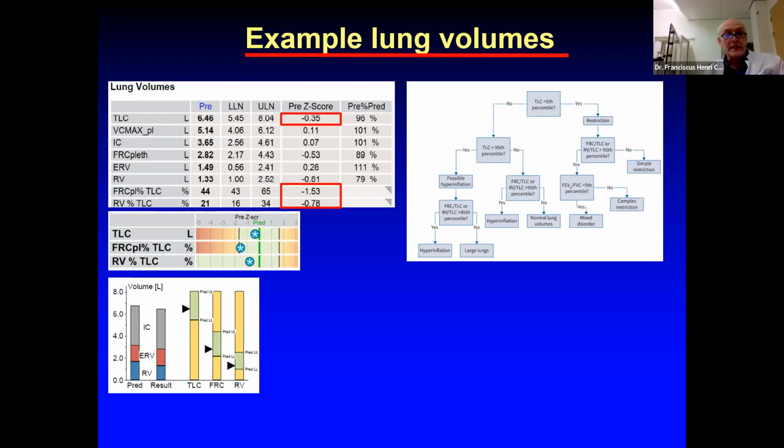And of course, in this example, I didn't give you, for instance, the BMI of the patient, because this could be a man, for instance, with overweight, having a high BMI, and therefore breathing on a low lung volume, a lower FRC, close to the boundary of being abnormal.